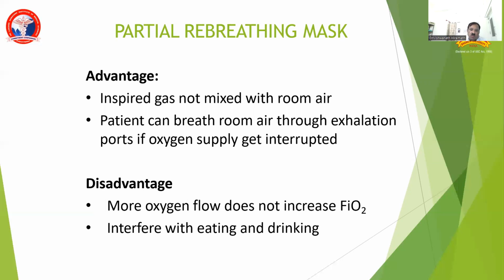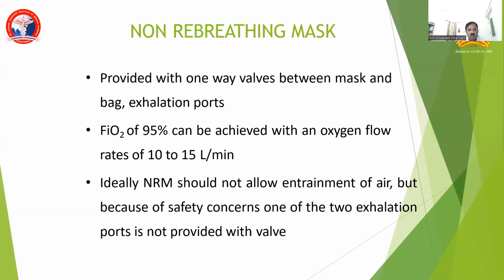Disadvantage: more oxygen flow does not increase FiO2. Interferes with eating and drinking. If the patient's hypoxia is not taken care of by partial rebreathing mask, that means oxygen saturation is not attained to the acceptable level of 94 to 95%.